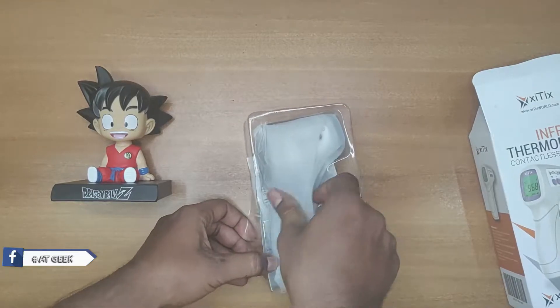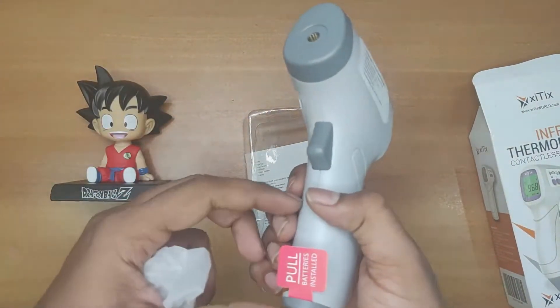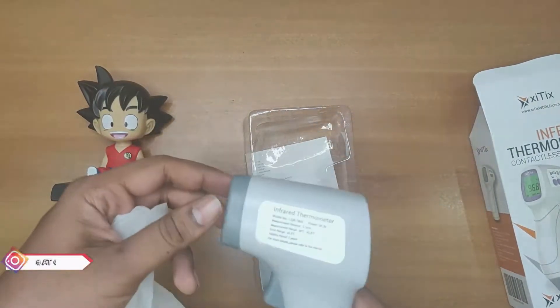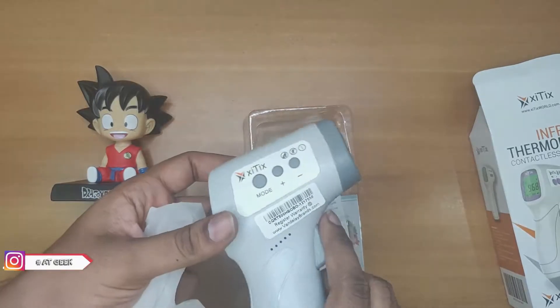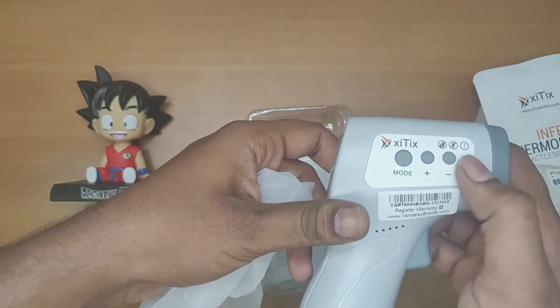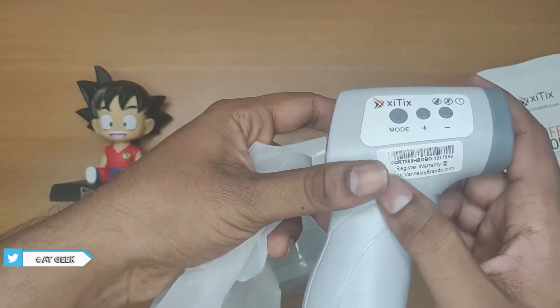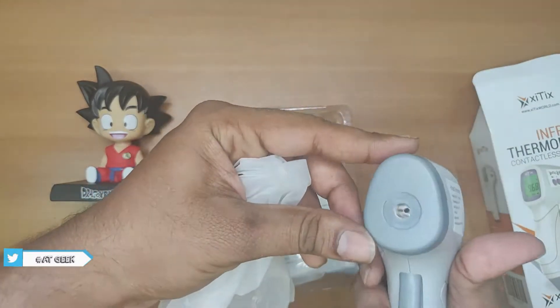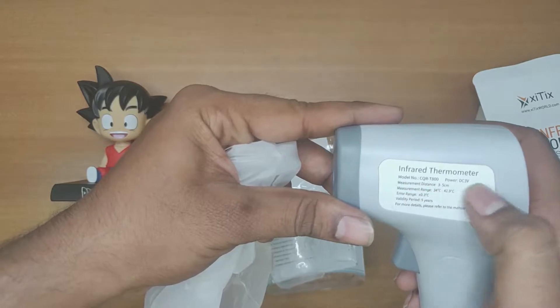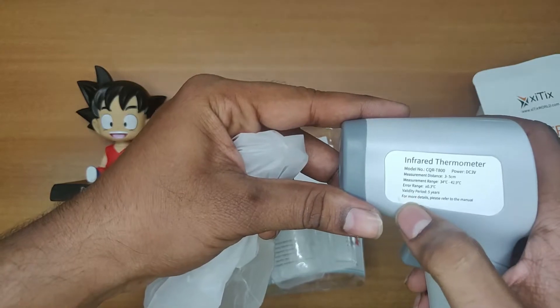Here we got the infrared gun. As you can see, we need to pull this to install batteries. You can see the temperature screen, the modes, and the plus and minus symbols. You need to register for warranty. The power is DC 3 volts and the validity period is five years.